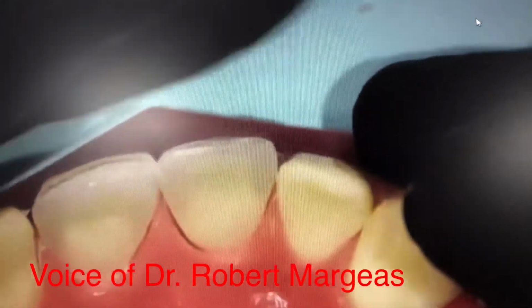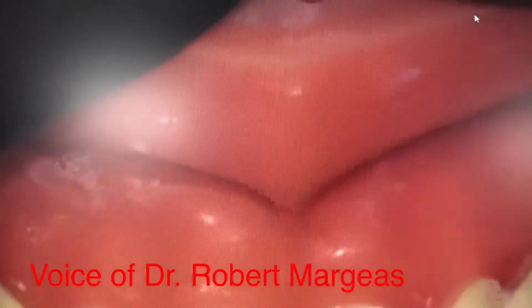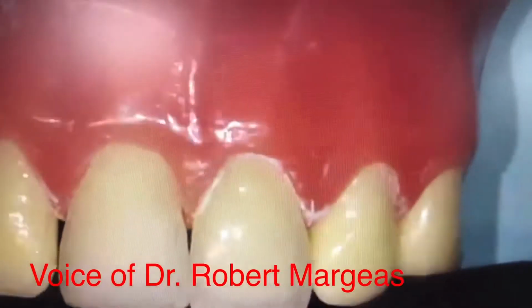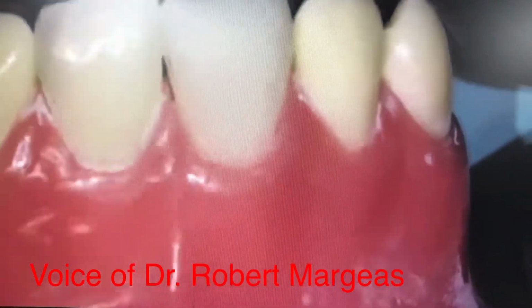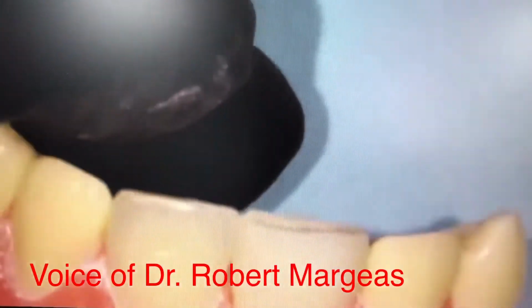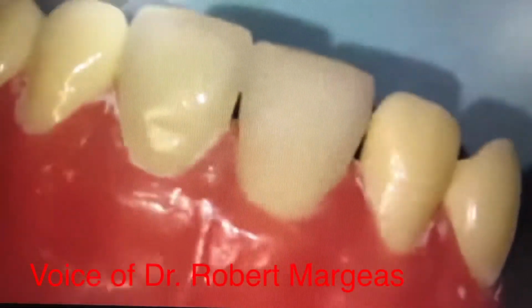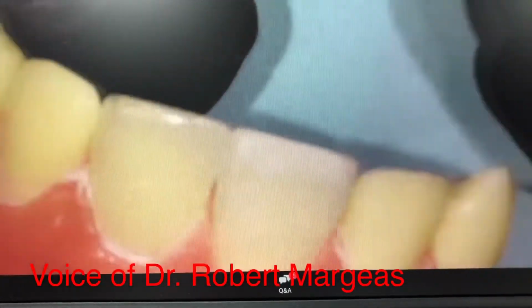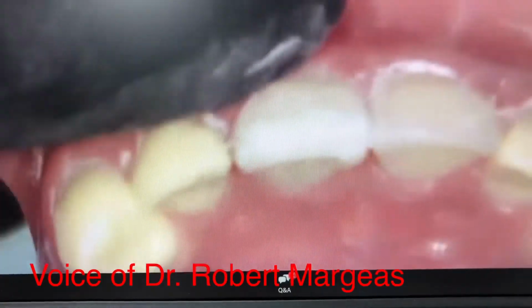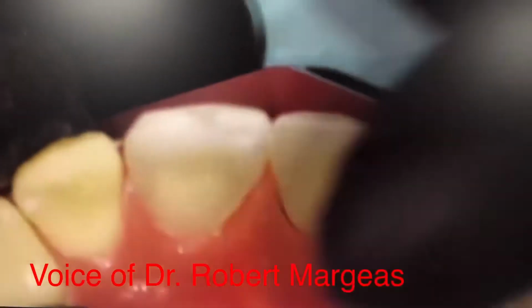I like to line up the facial incisal linings. You can see that's pretty close. And I want to make sure that I have the same length of tooth. Now, I do think that number 8 was a little bit shorter to begin with. When you looked at your tooth, it was a little bit shorter in the model to begin with. So I'm not going to shorten that anymore. But I want to make sure that I get this facial where I want it, like the adjacent tooth. I want to line up that facial incisal line angle. And then I leave that. Once I get it in the spot where I want it, I leave it. Okay?